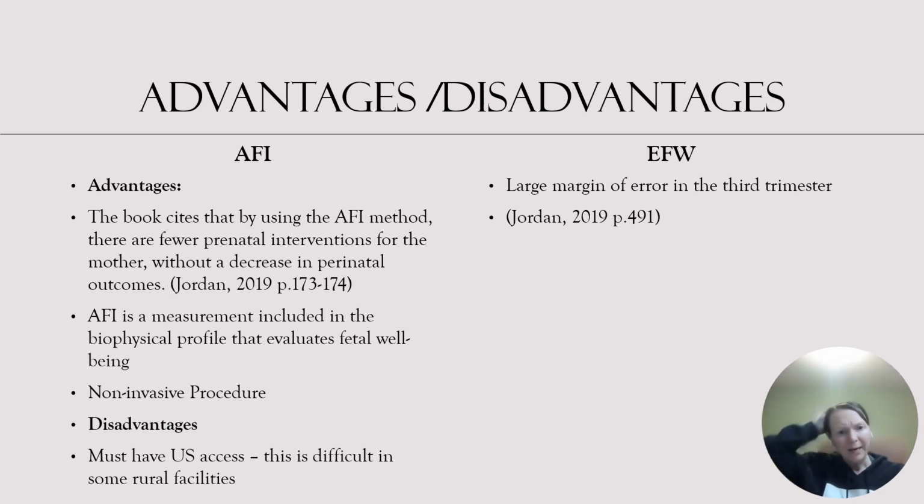The AFI measurement is also included in the biophysical profile that happens with fetal well-being, so that's an advantage. It's very non-invasive, just outpatient, and so that makes it easy on the patient.